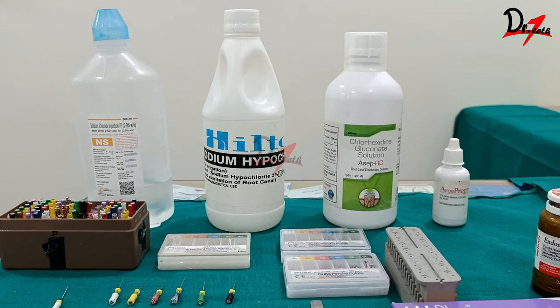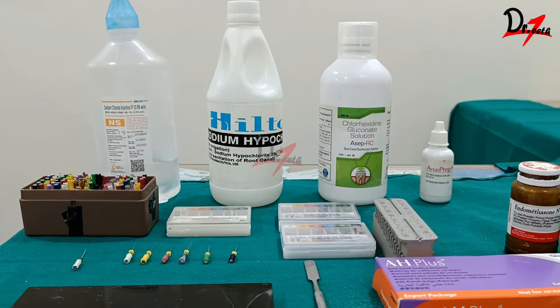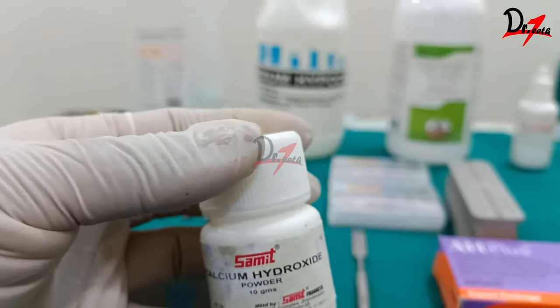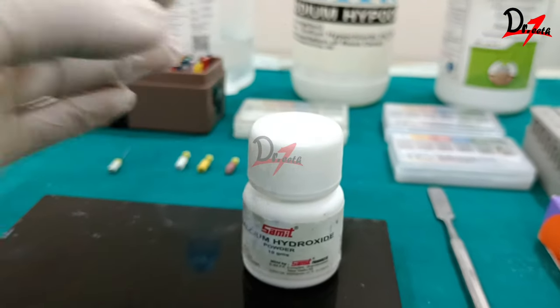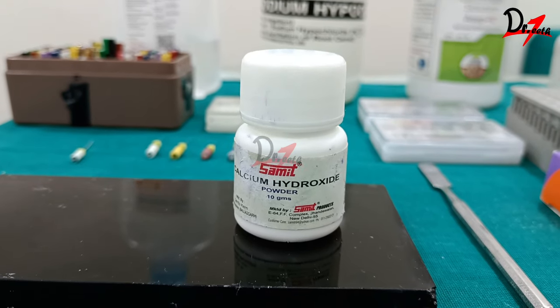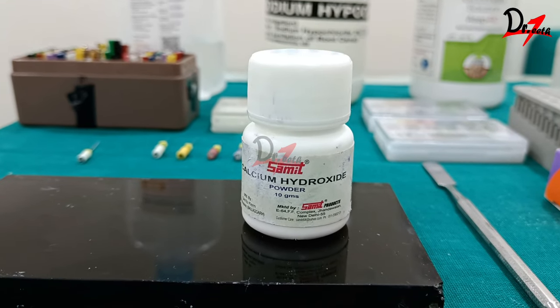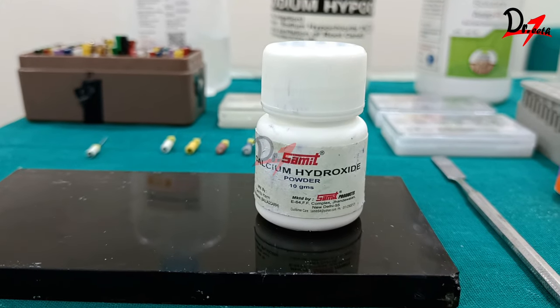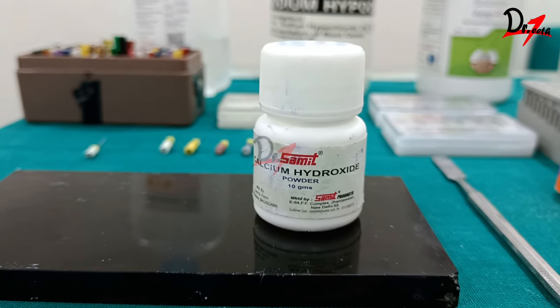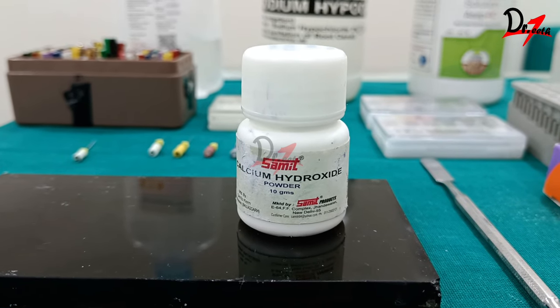This will be the final irrigation protocol. If you are doing a single-sitting RCT, you can directly use your sealer and obturate. If doing multiple sittings, you need an intracanal medicament, most commonly calcium hydroxide. Calcium hydroxide can be mixed with distilled water, saline, or chlorhexidine. Mixing calcium hydroxide with chlorhexidine increases antimicrobial efficacy — this is known as a synergistic effect. You can also use 2% chlorhexidine gel as an intracanal medicament.